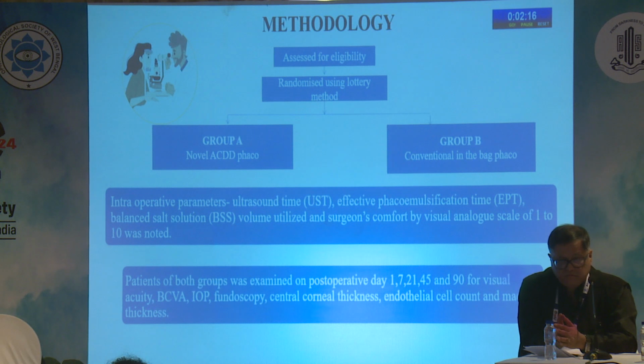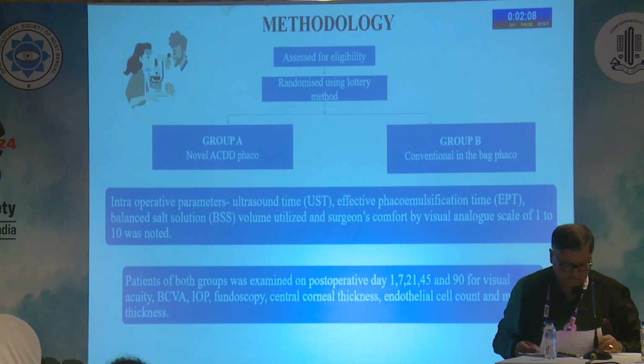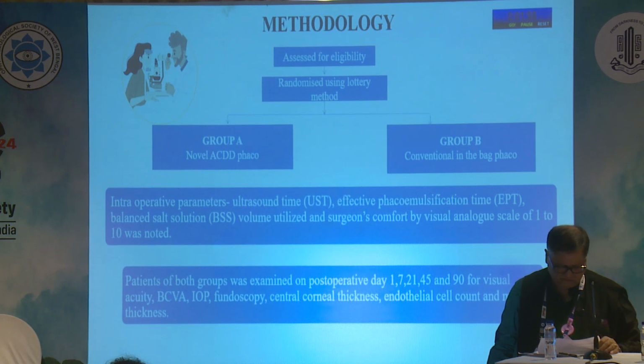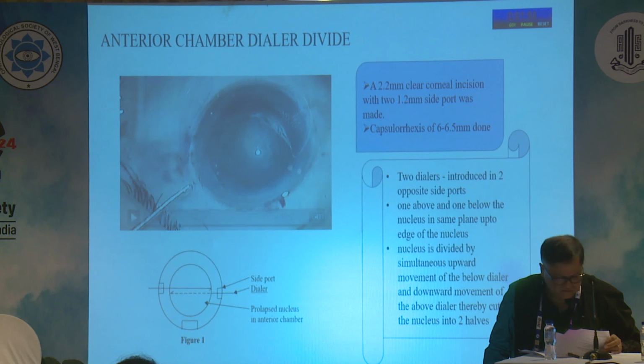All the patients were randomized into two groups using a lottery method. Patients in group A underwent novel ACDD phaco, and patients in group B underwent conventional in-the-bag phaco. Intraoperative parameters like ultrasound time, effective phaco time, BSS volume utilized, and surgeon's comfort were all analyzed, and follow-up was done for 3 months.